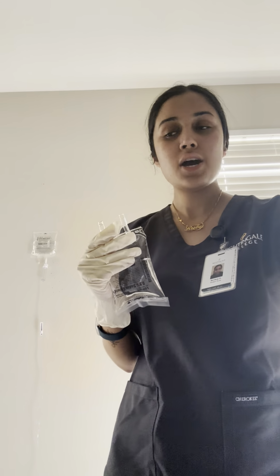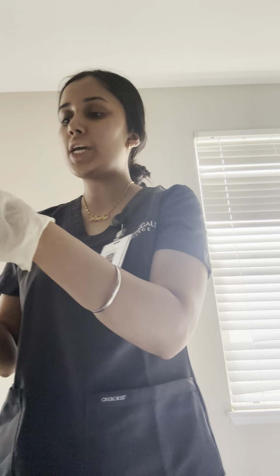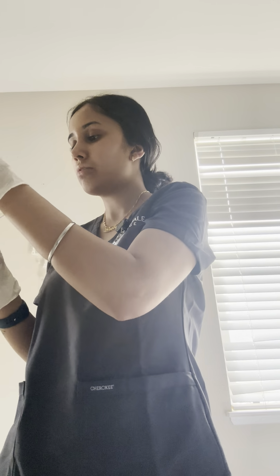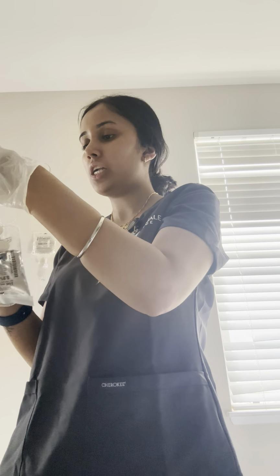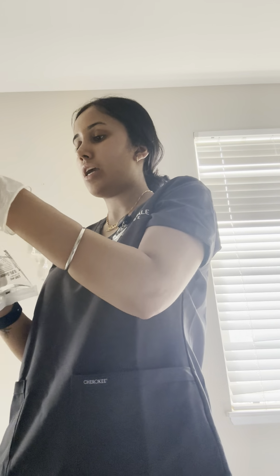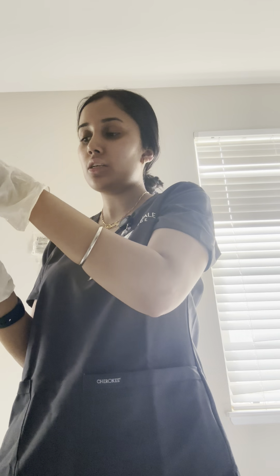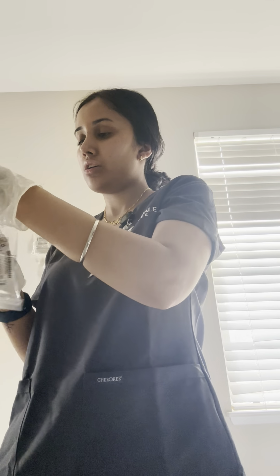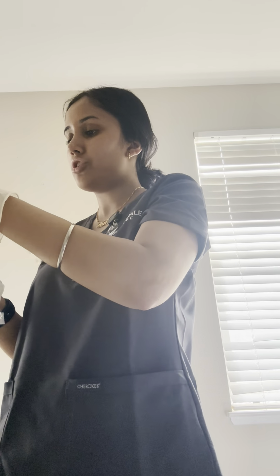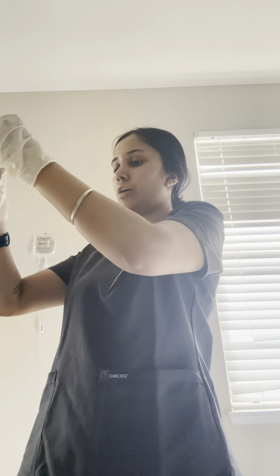It is off, and then you would insert the secondary tubing. So you take off the transparent cap off the spiking, and then the spiking goes directly into the fluid bag. You twist and turn it until it is secure in there, and make sure you take your time with this. And then what we do is we turn it back over.